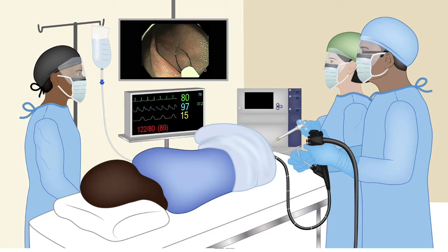As you can see here, we see a small polyp on the screen and we decide to remove it with a cold snare. Unlike a hot snare, which requires connections to the electrosurgical unit, with a cold snare you don't need any of that. You remove the polyp by simply using mechanical transection or a guillotine effect.